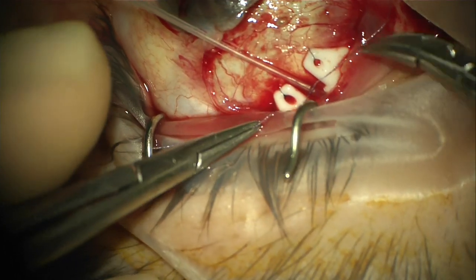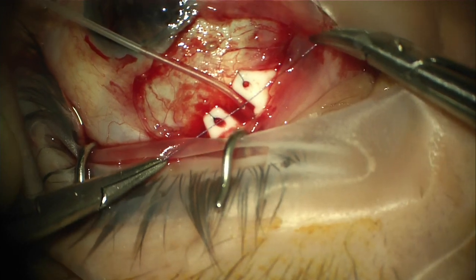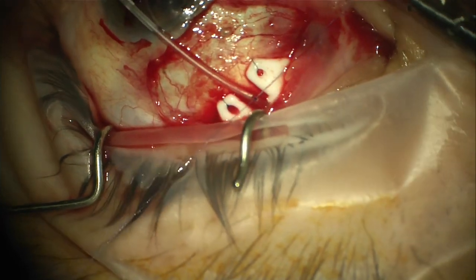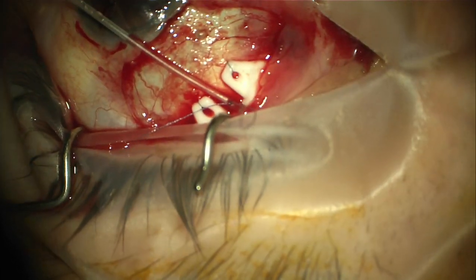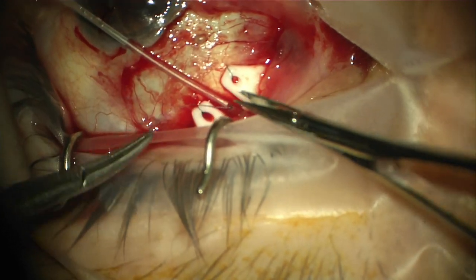Because it is a non-valve device, we are ligating the tube close to the plate using a 7.0 micro suture. This should dissolve at approximately 6 weeks post-op, allowing flow once a capsule has formed around the plate of the device.